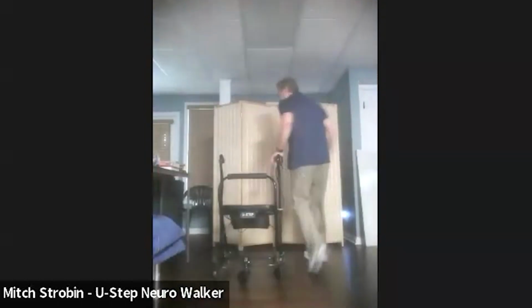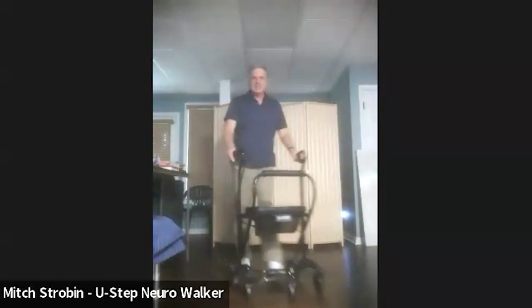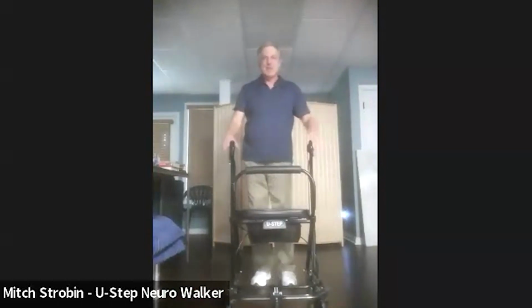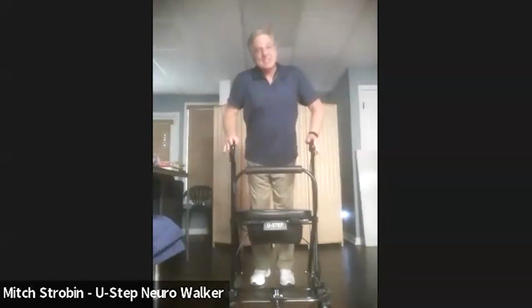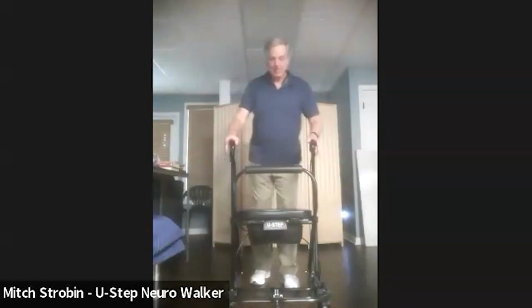Okay, so here I am. Hopefully I'm still there somewhere. So we talked about the U-Step doesn't move unless I want to move. Remember safety? So, oh, I'm leaning on it. I'm over 200 pounds and we're not moving. And this is good for 2 reasons. Number 1, if I fell, this talk would be over, and that's not good. But number 2, okay, good, a smile.